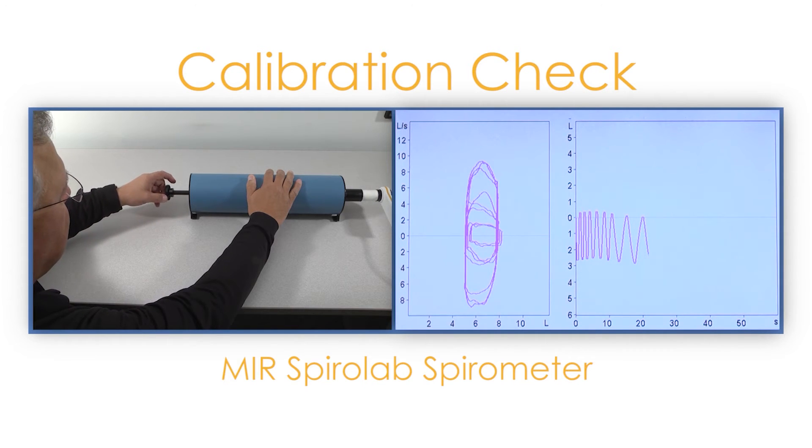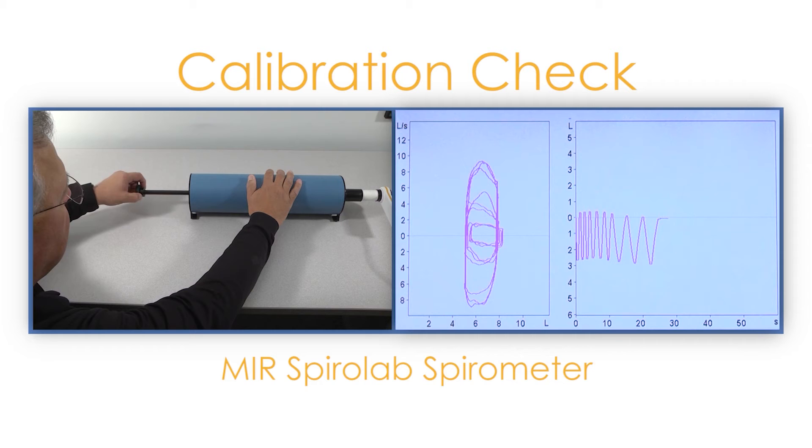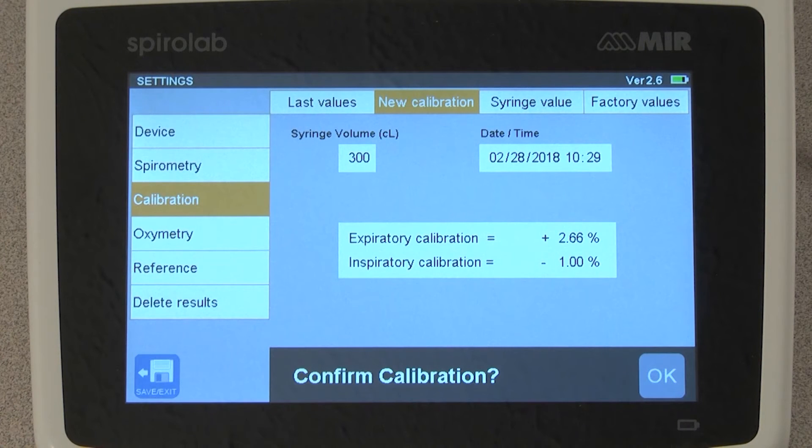And finally for the low speed, push the plunger in at a very slow speed and out at the same slow speed, repeating two more times. At the completion of the slow speed, stop and the device will automatically calculate the results and show you the expiratory and inspiratory calibration check numbers. We are looking for the calibration check to be within plus or minus 3%. If this is within the range, tap OK and the calibration test is done.